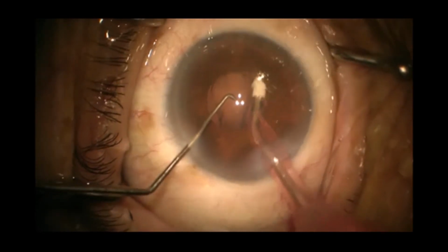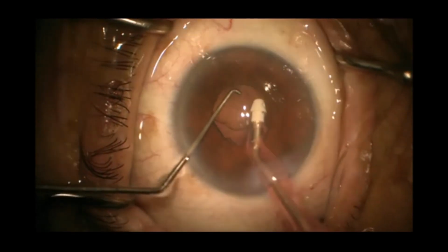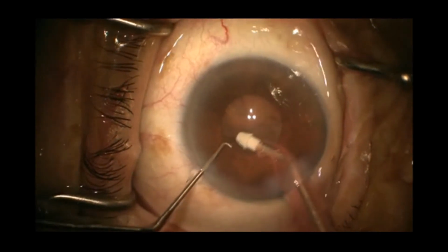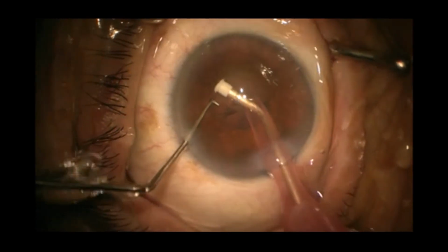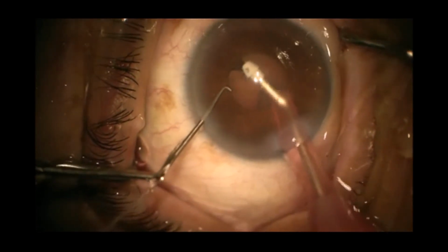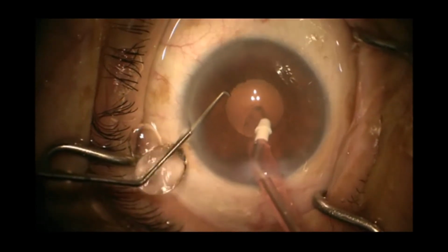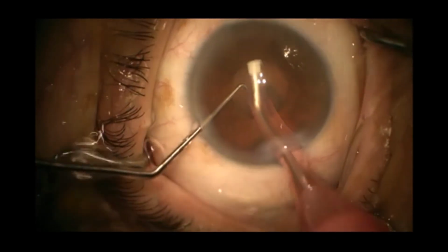My preferred mode of cortical aspiration is coaxial irrigation aspiration. I'm going very slow, sometimes under the pupil, aspirating the cortex. Here I am having a little struggle for my subincisional cortex. I plan to tackle it at the end of it.